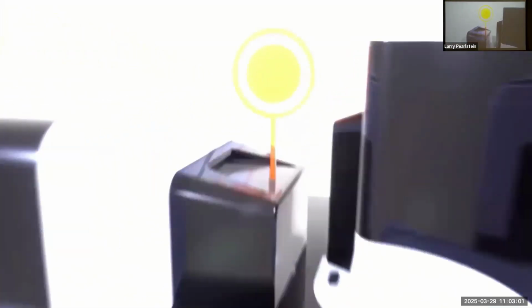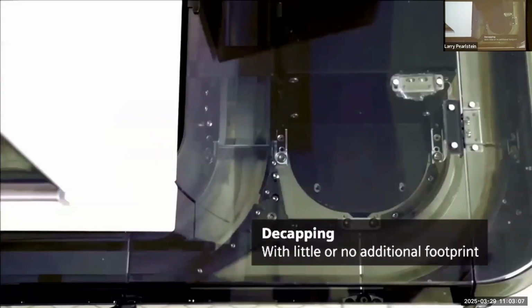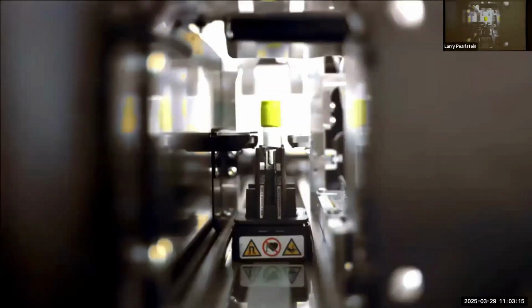And of course, because it's on Ethernet, managers can watch it in their office. I don't think though that you can run it from home because you have to load the samples and then take the samples out when you're done.